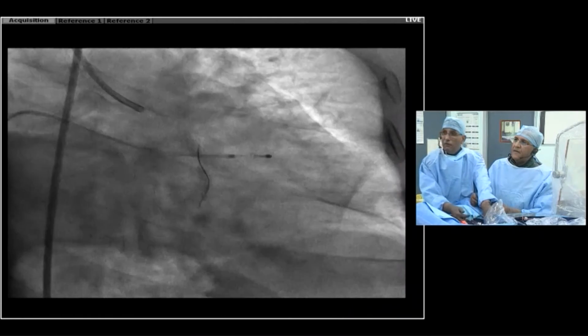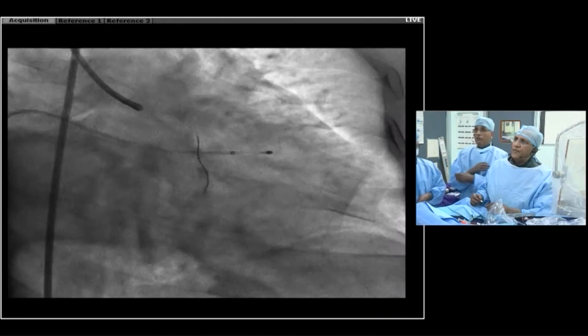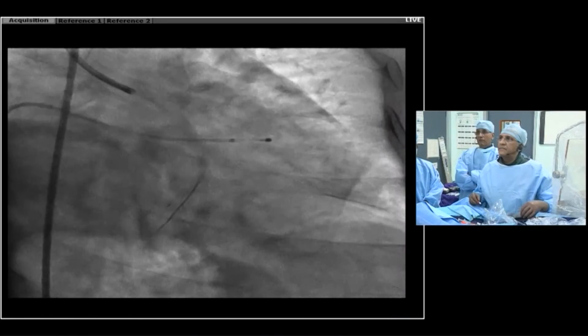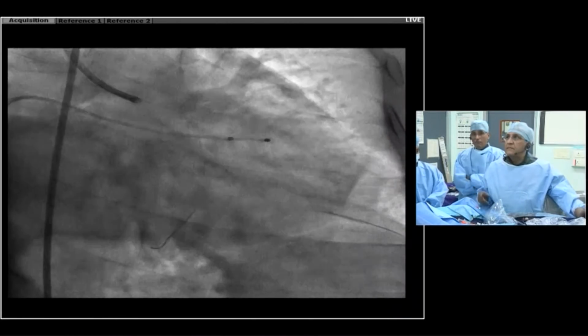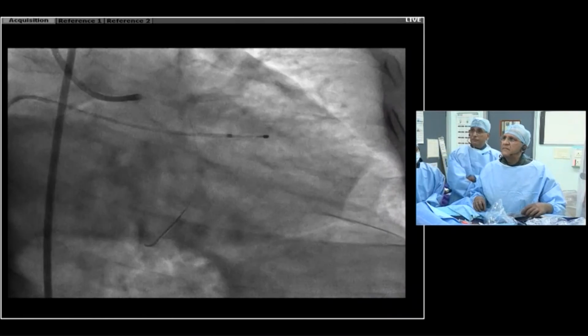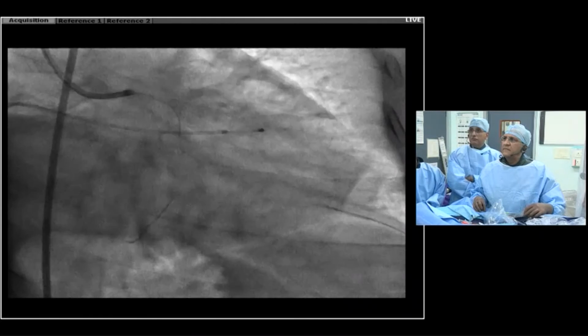And that's, I think, one of the differences with rota and orbital. For orbital, we would actually glide assist through the proximal, perhaps, and then dynaglide, and then go later. So that's a nice thing to be able to do. But for rota, I think most people platform in the left main and then just atherectomize to move forward if it doesn't push. We don't have orbital available here.